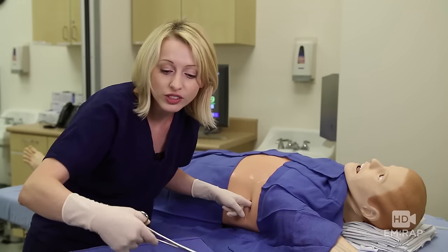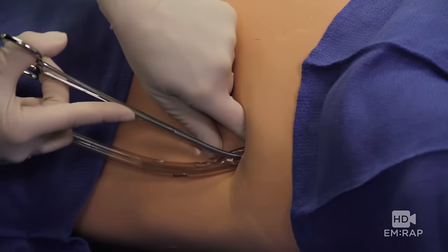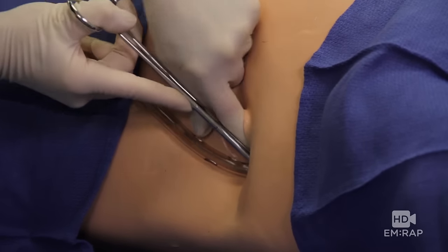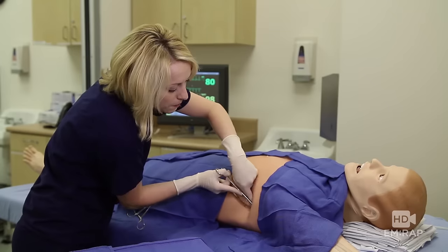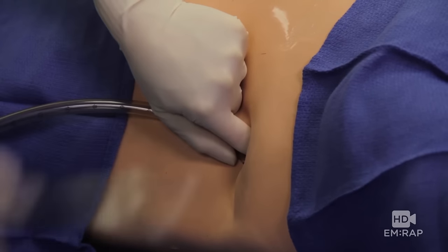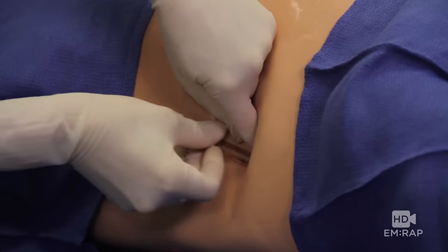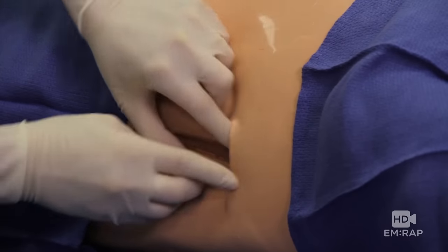Now we can take our chest tube and insert it superior posteriorly towards the apex. Guide it along your finger and insert it until the last hole is all the way in. Perfect.